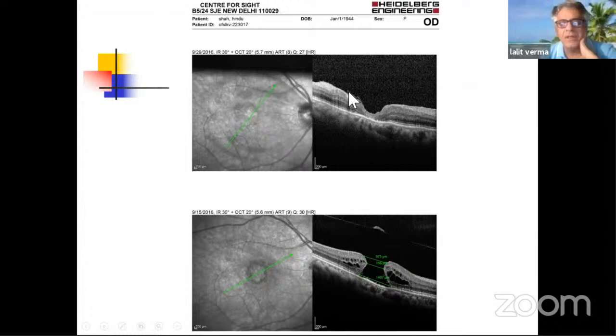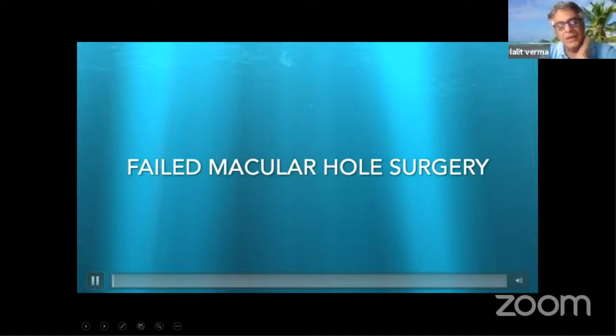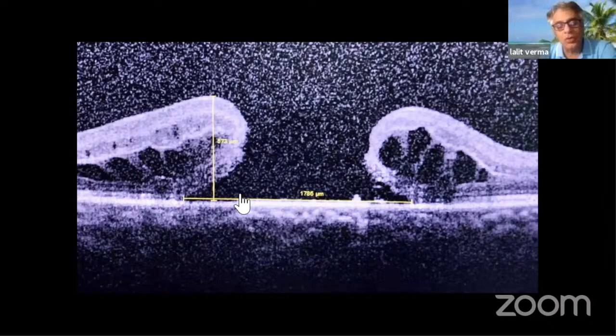So these are the results. You can still see ILM in the upper photograph, which is still adherent to the surface, but morphology has come back. This was nearly 1500 microns preoperatively. This was another patient of more than 1100 or so, reasonably okay result at the end of a couple of weeks. So the main aim was to show this video, which the surgery was done at our center only. And after the surgery, the hole was 1800 microns.